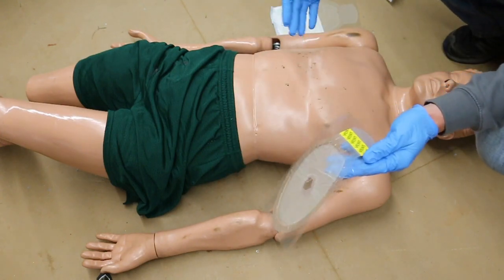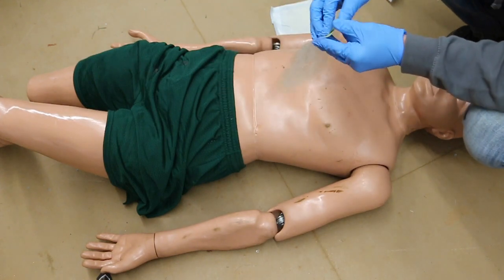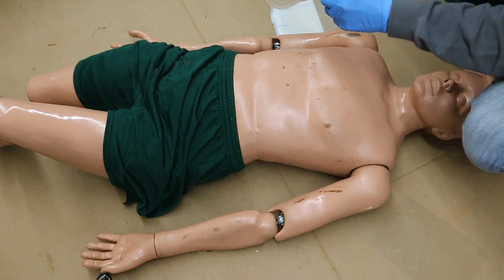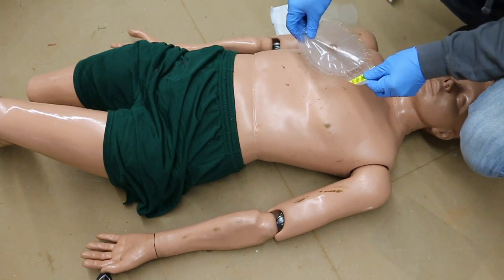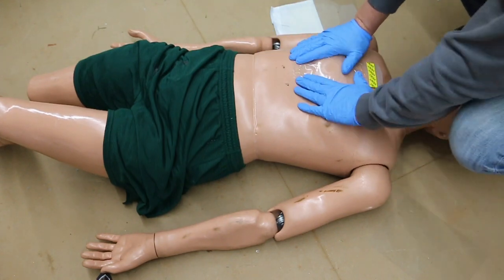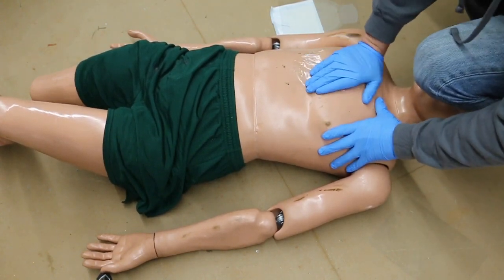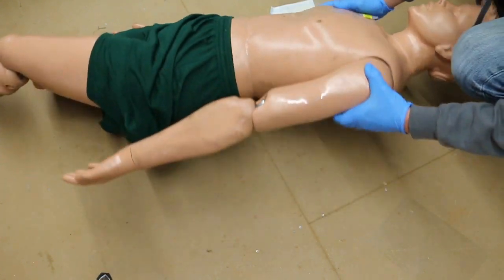Another hole. Maybe he was running from the guy. I don't know. So, got a hole here. Pull the tab. Put this hole over the center of our pretend hole here. Doesn't really matter which direction you put this in. Okay. Push it down to get a good seal. Okay, we're good. Now let's log roll him.